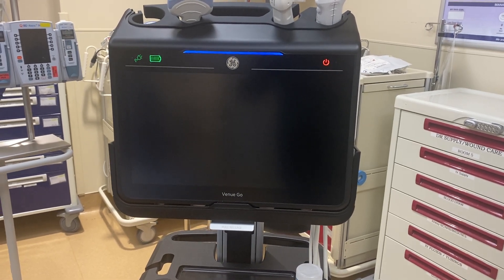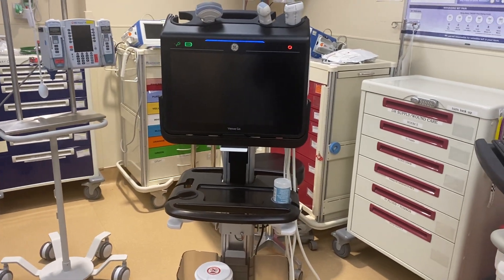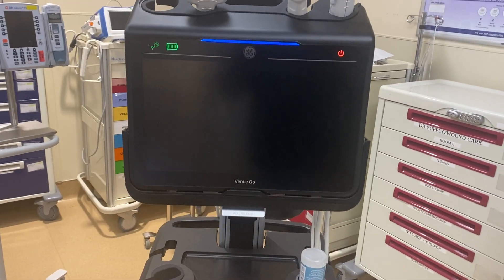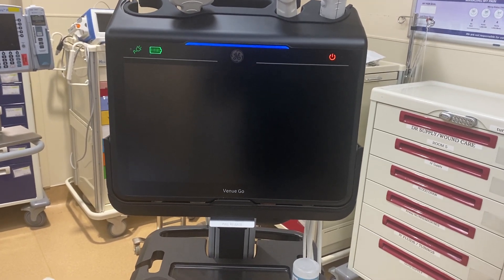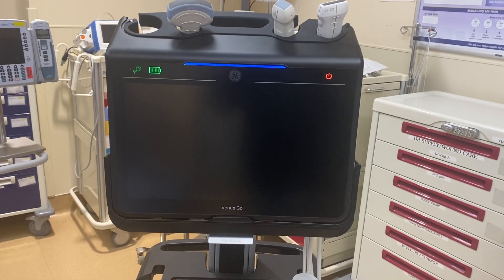Hi everybody, this is Dave Bosch. I am here at Southlands with our new ultrasound machine, the GE Venue Go. I want to do a quick tutorial on how to start this machine up and log on and upload patients into the worklist so that everyone working here can start using the machine as soon as possible.